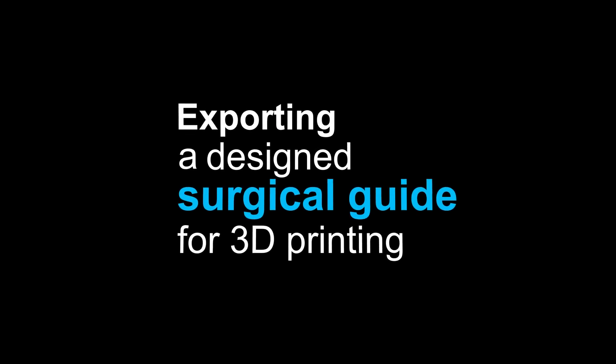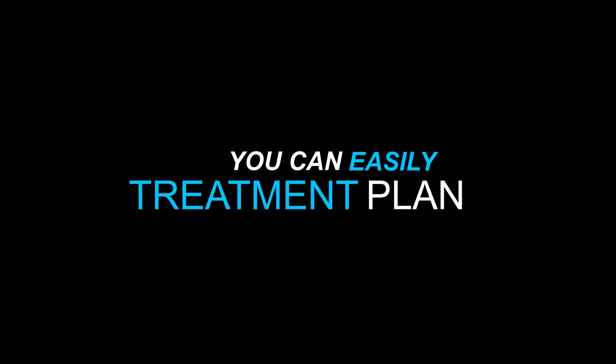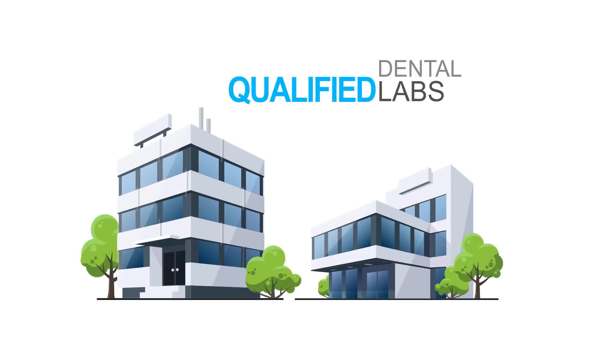Exporting a surgical guide for 3D printing starts at just $11 a case. With Blue Sky Plan, you can easily treatment plan and design your surgical guide yourself, or you can choose to work with one of our qualified labs.